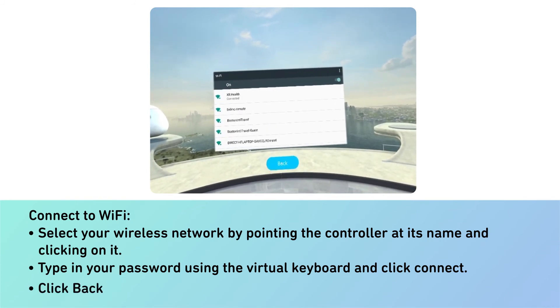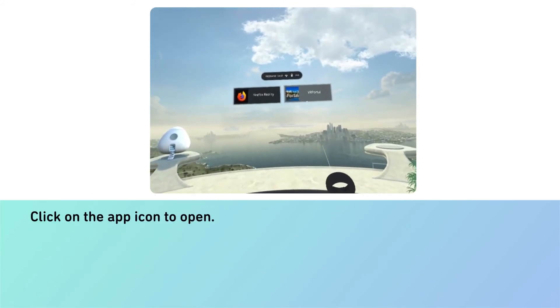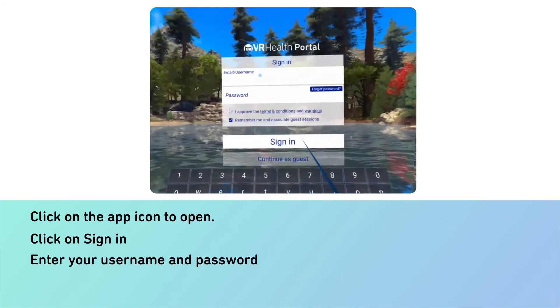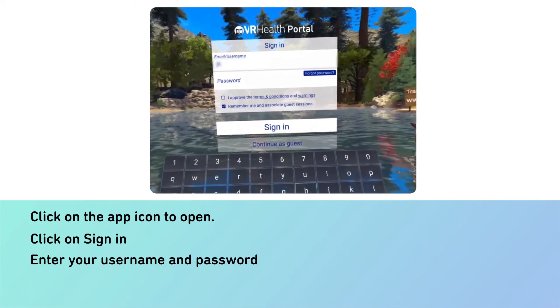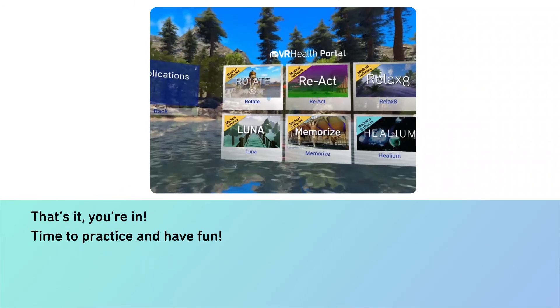Click back. Click on the app icon to open. Click on sign in. Enter your username and password. That's it, you're in. Time to practice and have fun.